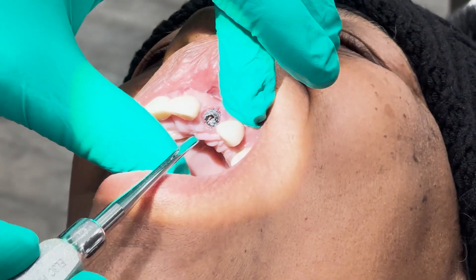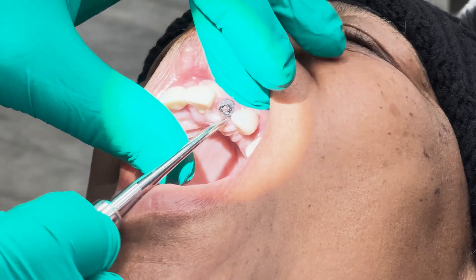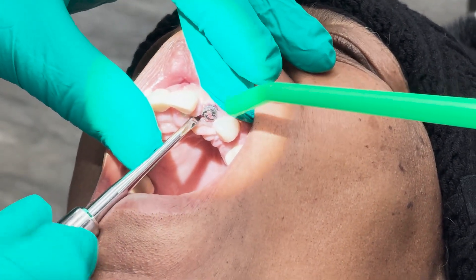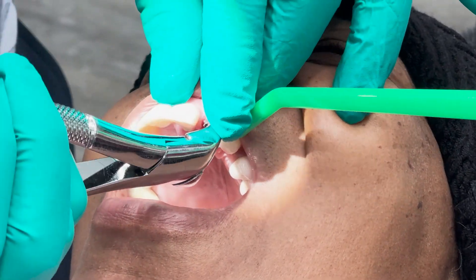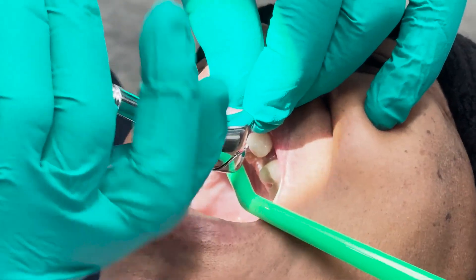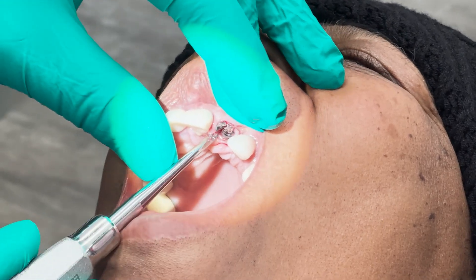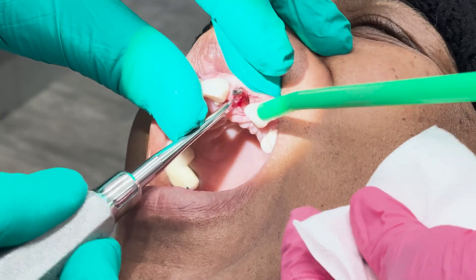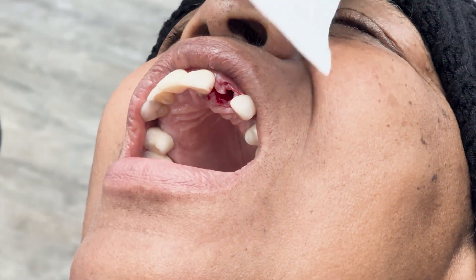Lift your chin up just a little bit. Here it's coming — just loosen it up. That's going to come out in pieces because it's pretty badly decayed. Let's see if we can get that out. There we go, and there's the rest of it. Okay, we got the whole tooth out. As I like to say: the tooth, the whole tooth, and nothing but the tooth.